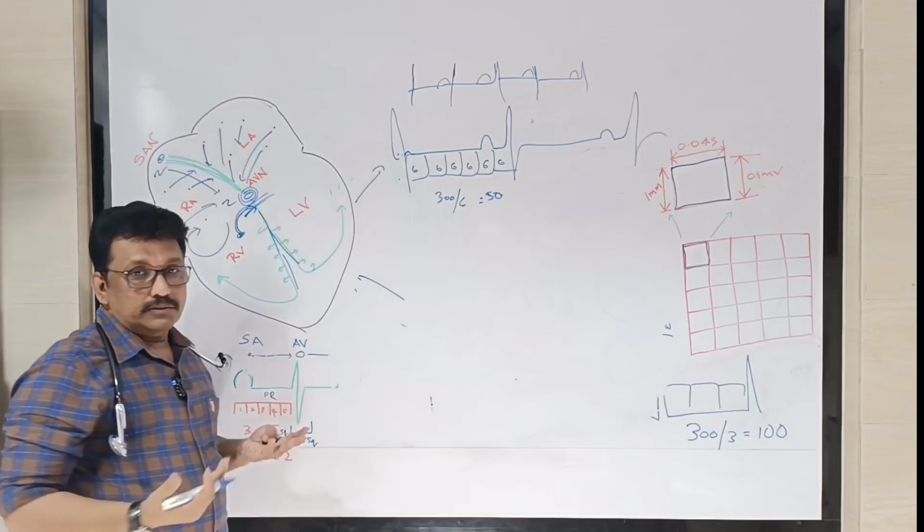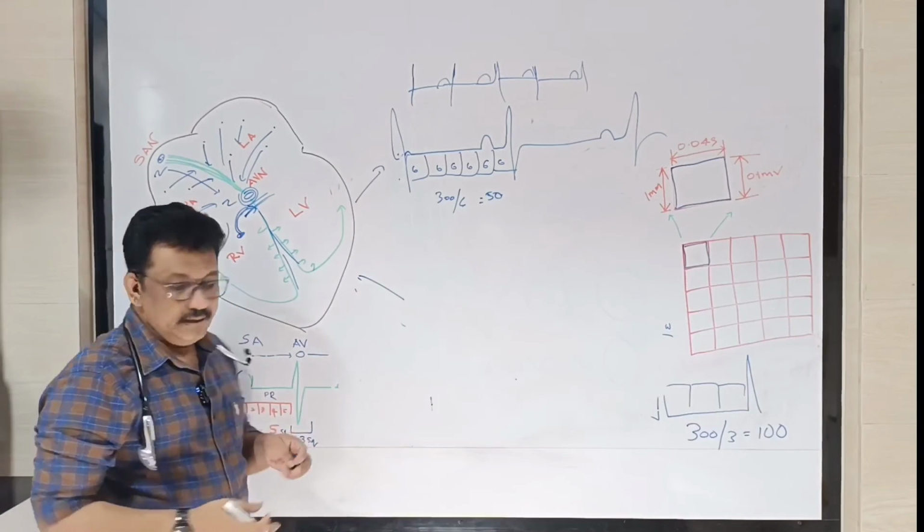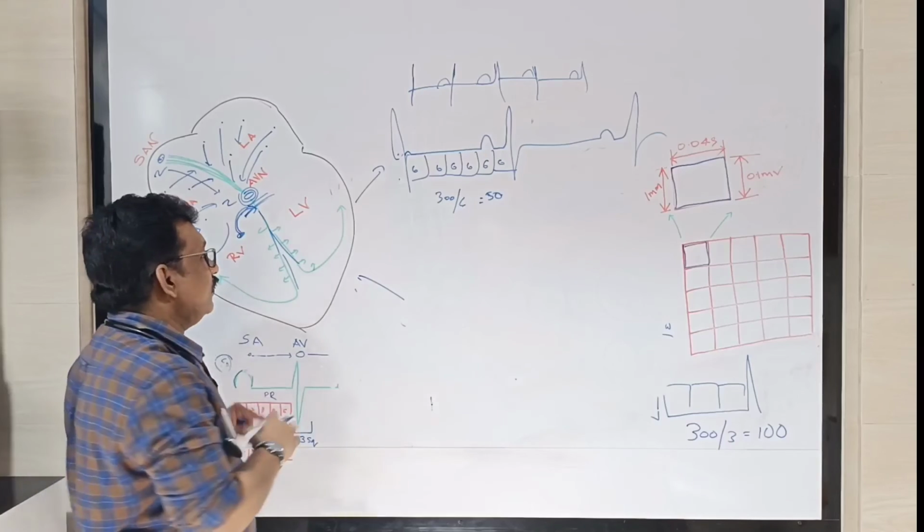Now we will see blocks, heart blocks. What is heart block? We will see. Then you will understand other causes for bradycardia.